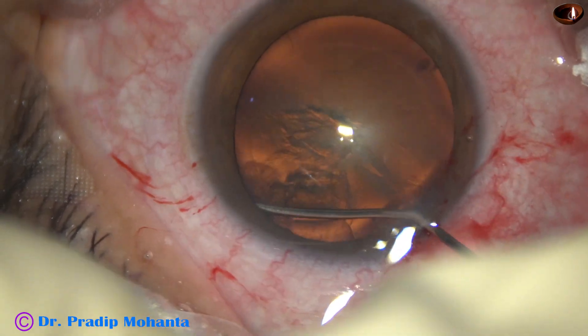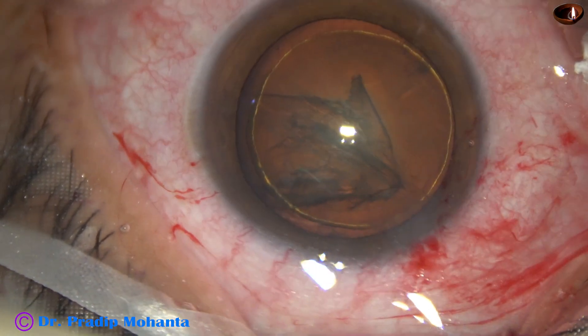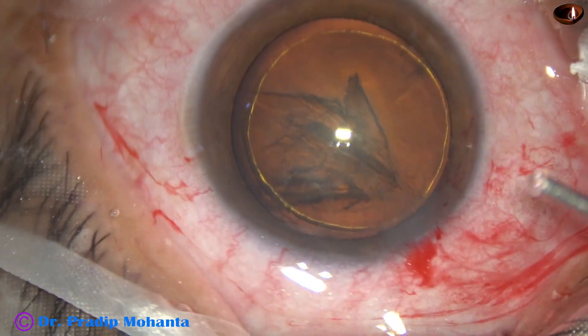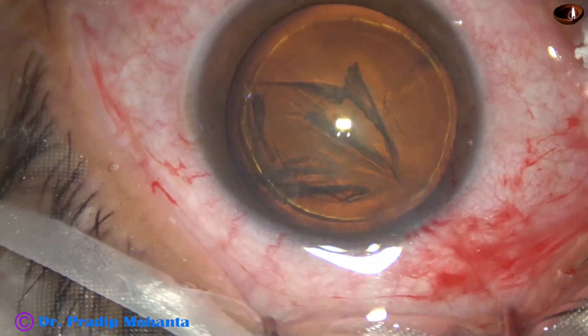Hydrodissection is done. Hydro-delineation is also done. Visco again fills up the anterior chamber.